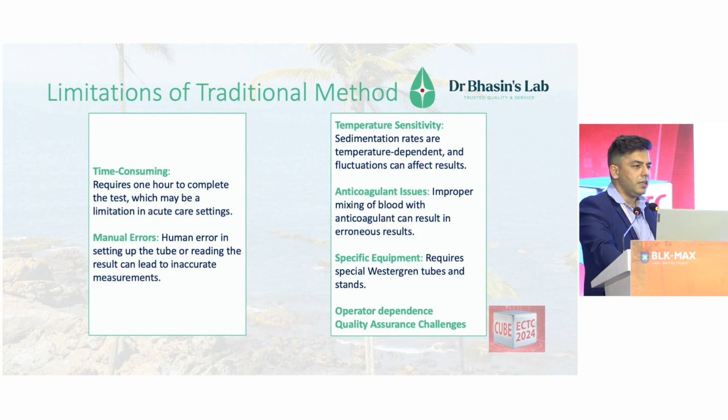Now the limitations in the traditional method is that it's time consuming, requires 1 hour to complete the test, which may be a limitation in acute care settings and where urgent reports are needed. Further, the time consumption is not just about conducting the ESR, it is the comprehensive TAT of the patient, because for CBC, for instance, the analyzer is taking 60 seconds, but it takes us an hour to give out even an urgent report. Likewise, in hospitals or big institutional setups, they have segregated labs, so multiple EDTAs may be collected. But for standalone labs, especially preventive health checkups, which form 25% of laboratory business by all data, we are just collecting one EDTA. So that same EDTA we have to run CBC, then we would perform an HbA1c on that, and then it would go for ESR.